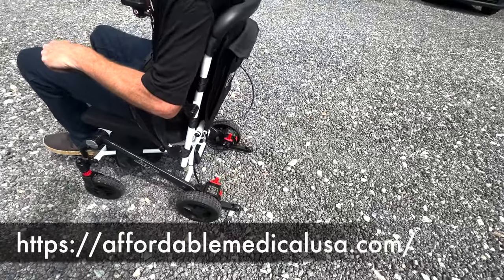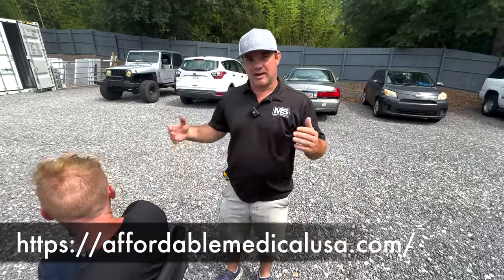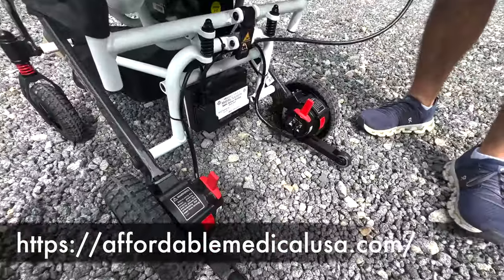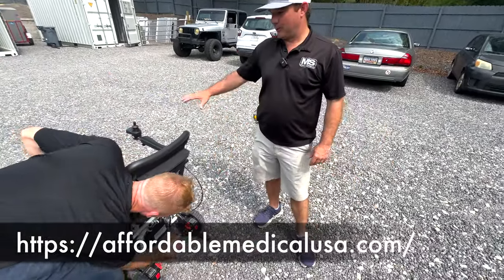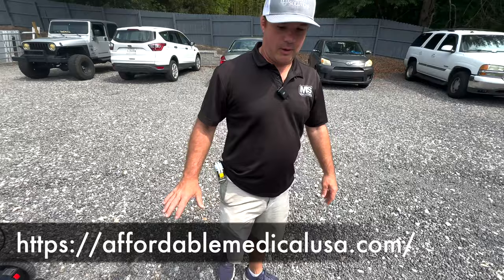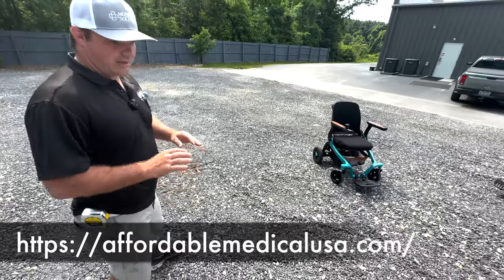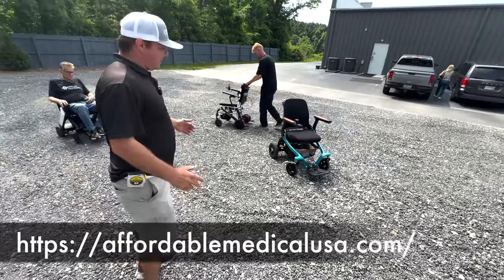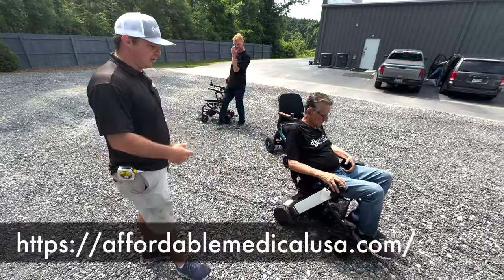All right, let me explain something. If this happens to you and you have one of these chairs, most of the time people have mobility. They need this for distance. You might have to get out of this, put this in free wheel, and get it through the situation. This is just what it is. If you're buying this to go through this stuff, don't buy it. Don't buy any of these 3 power chairs if your primary use is really thick gravel. If your driveway is gravel but it's compact and not so thick, you should be fine going down to the mailbox and back. It's almost like buying a pair of shoes. I hate to say it. You got your work shoes, you got your running shoes, and you have your boots.